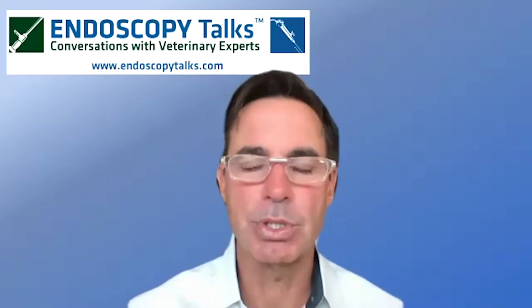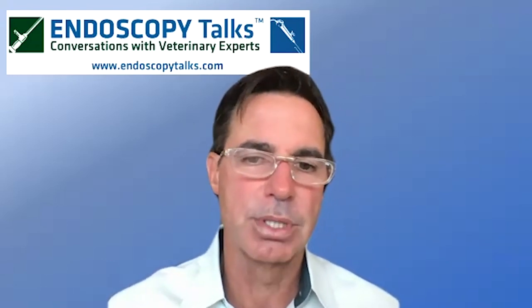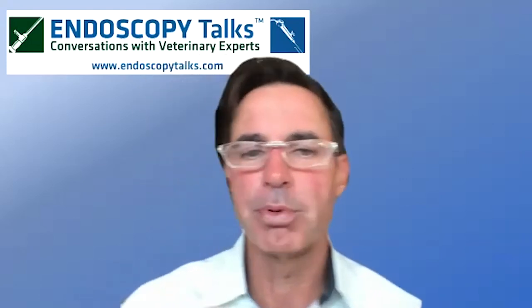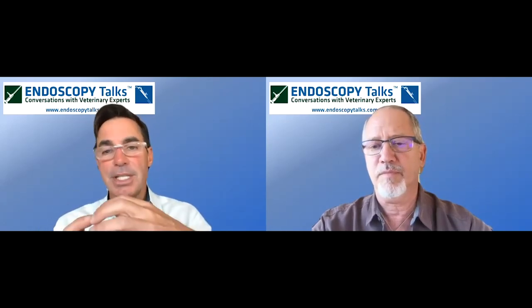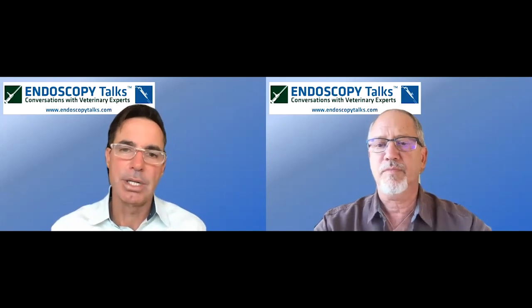I've never been able to find an article when I've searched the databases that show that those torn fibers actually promote arthritis or synovitis. What has been shown in multiple studies is that if those fibers are functional and you perform a TPLO or a CBLO, you can save those fibers. And then they will provide not only rotational stability, but more important than that, they will help prevent future meniscal tears. So if you take the whole ligament out, you're going to have a joint, even with TPLO or CBLO, that has dynamic stability, but it does not have static stability. So you still get cranial drawer, and we will see a much higher likelihood of meniscal tear.